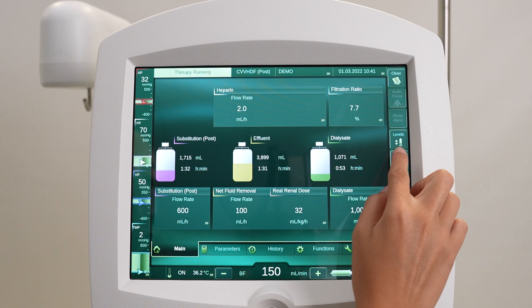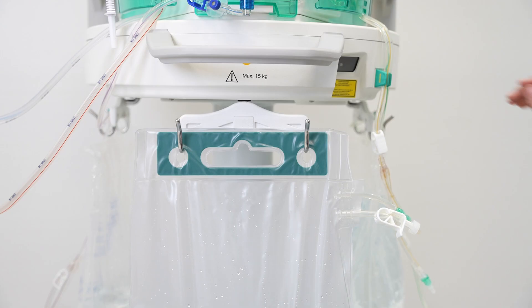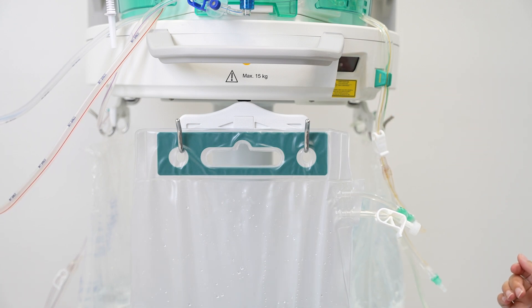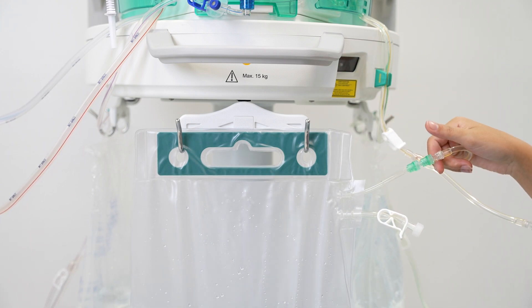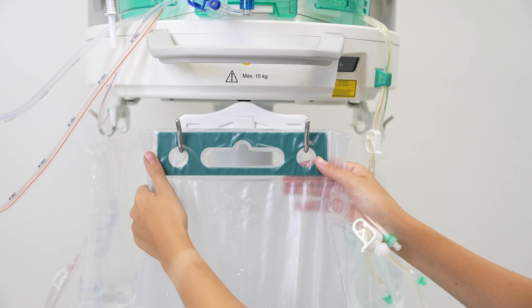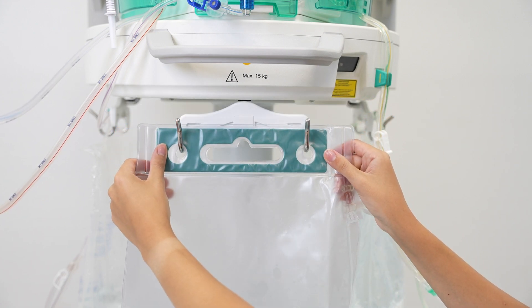To start the effluent bag change procedure, press the bags icon to enter the bag change screen. Clamp the yellow effluent line and the effluent bag if needed. Disconnect the effluent bag from the effluent line and unload the full effluent bag from the center load cell. Hang one or two new effluent bags on the center load cell.